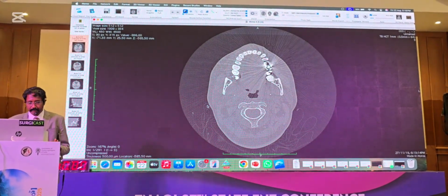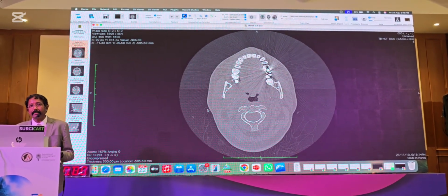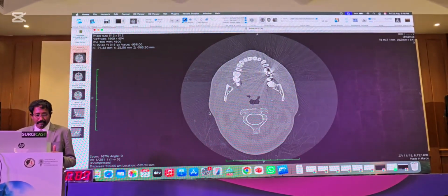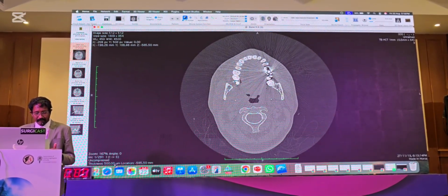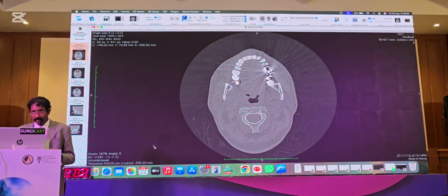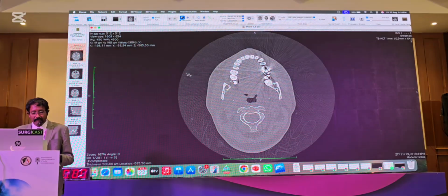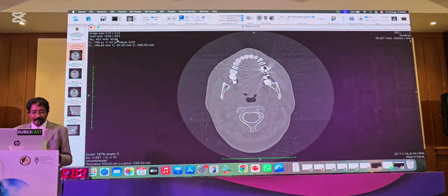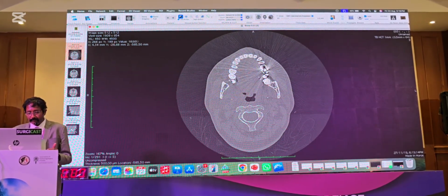So this is an HRCT of the paranasal sinus, and it's in axial view. So that's the default view. So here you can see the thickness. This is 500 micron. That is almost 0.5 mm of cuts being taken. Okay. So here the image size is being mentioned. 512 into 512. That's the matrix. And what we are seeing is a little magnified view.